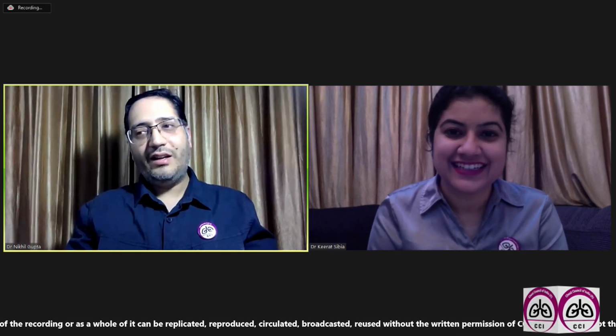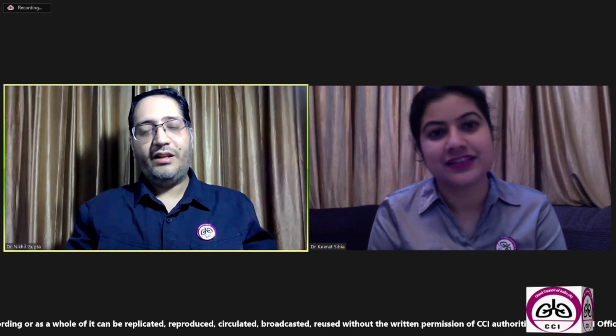Also, we see in the AP window, if there is a convexity in the AP window, we can see, and the paratracheal stripes, widening of the paratracheal stripes. All right. Thank you for that.